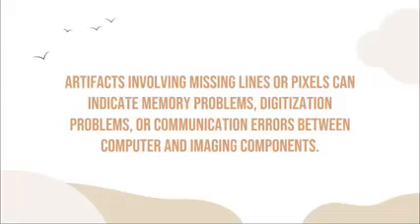So as I have said a while ago, na pag na ay missing lines or nangamatay yung pixels, nag-malfunction yung pixels, interpolation can be the solution to your problem. Okay? Pero ang cause ana is most likely nasa memory, digitization, and communication errors between the computer and imaging components. So between the imaging plate and the computer and the reader. Yan. Yan ihang gawas. Okay? So pixel dropout na siya. So ang solution ani niya is again interpolation para ma-fill in ni siyang mga gaps dito.